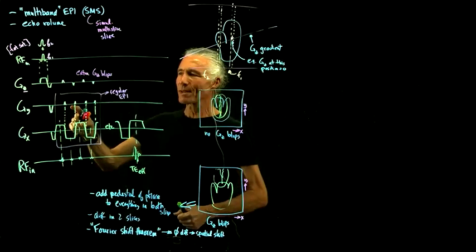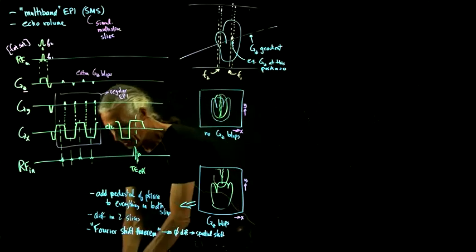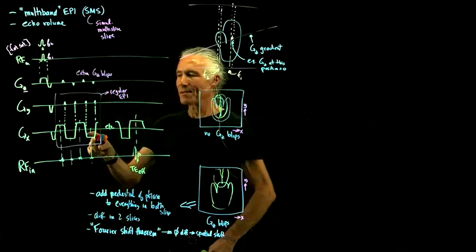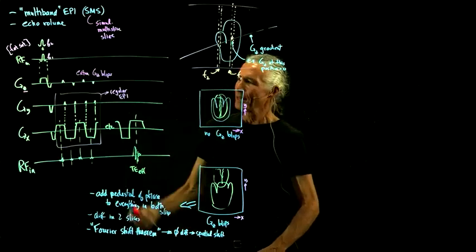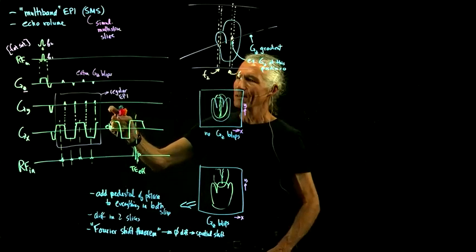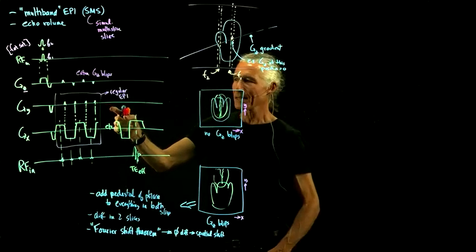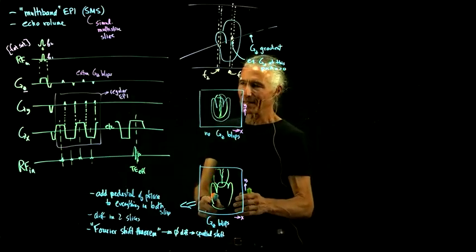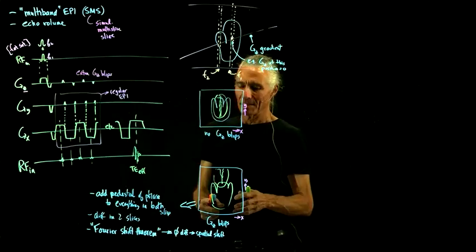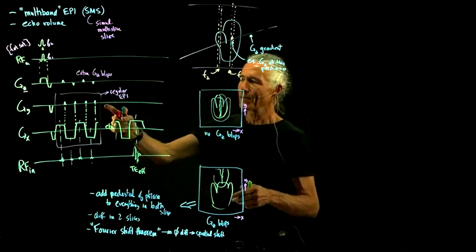In the y direction, we've got these tiny little blips, which are much smaller relative to the gigantic ones. And so if you mess something up with the phase, it's going to affect the y direction a lot more. To fully understand this is like 2 weeks from now. We haven't come to that. But the end result is that you basically just shift stuff in the phase-encode direction.